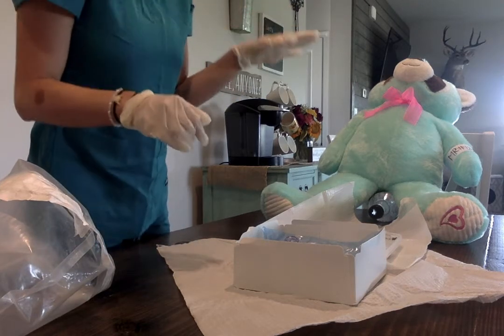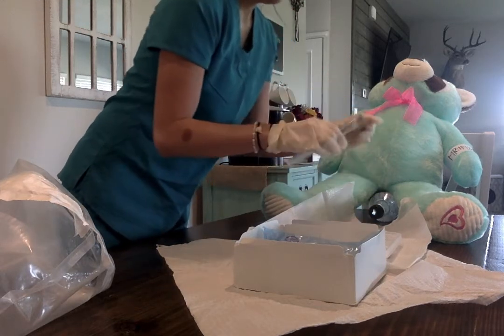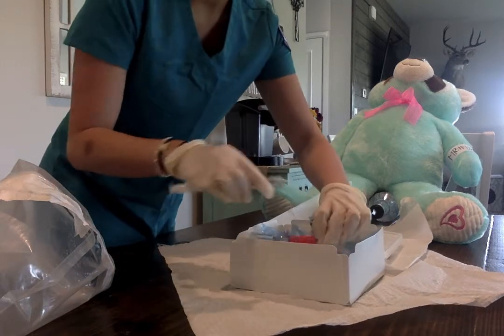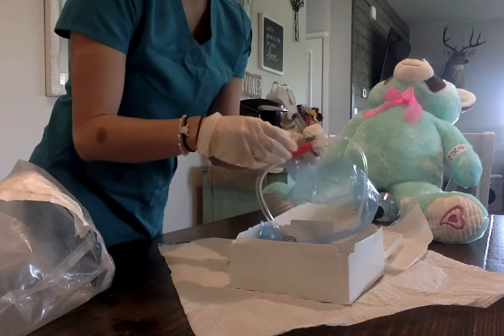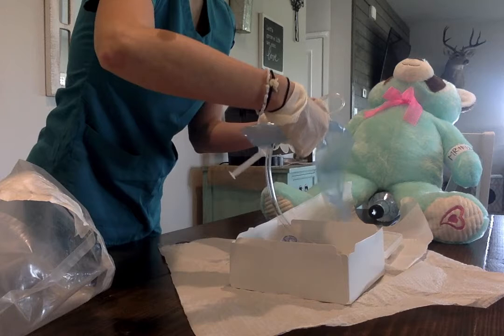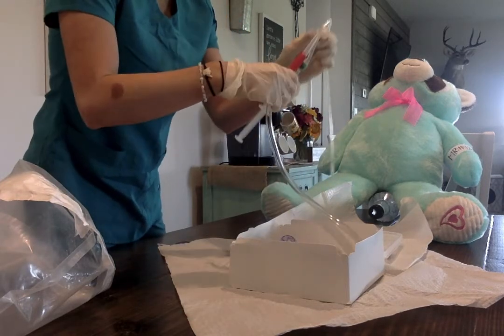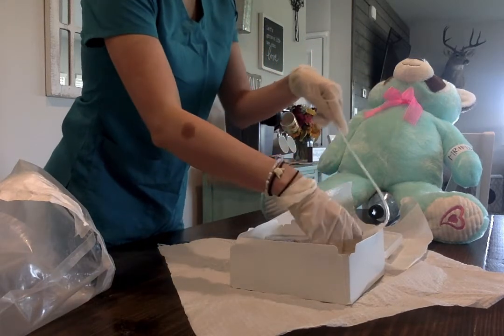Alrighty. Now I'm going to attach the pre-filled water right here onto the catheter. And I'm going to get rid of this blue thing, trash. Okay. Alrighty.